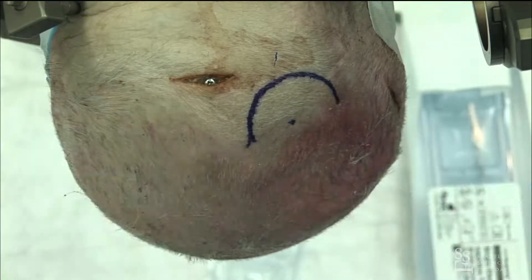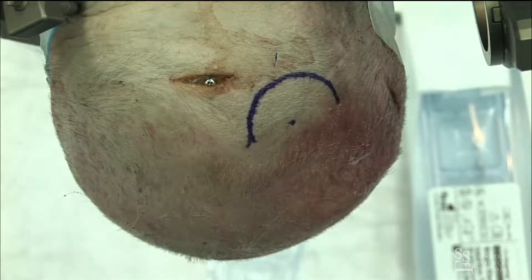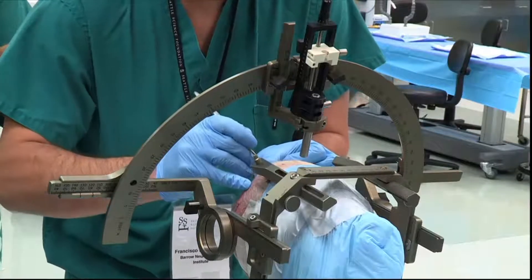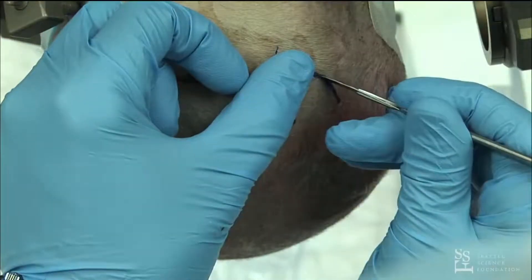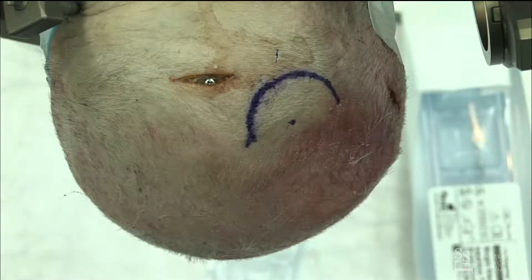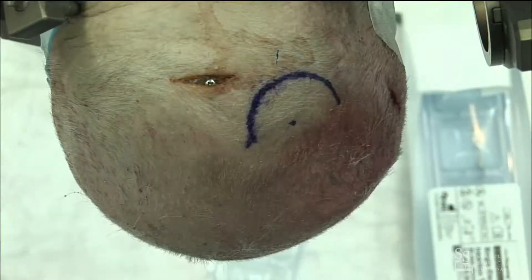I've got a little pen here, and I'll use a medicine cup once I make that little dot. A medicine cup has the perfect diameter for our burr hole and Stimlock, and it gives you a nice semicircle. I use a flap and I'll countersink — the flap really heals nicely. Obviously, we prep and drape in the usual sterile fashion, so we'll make our incision. Our incision is specifically planned so we're really right where we want to be for our burr hole.